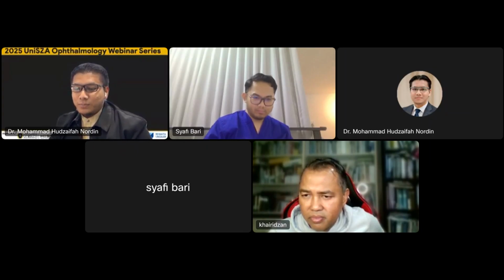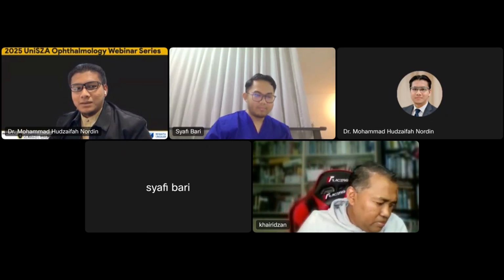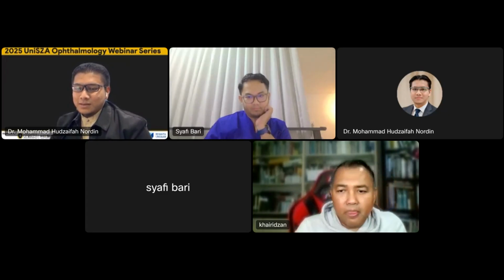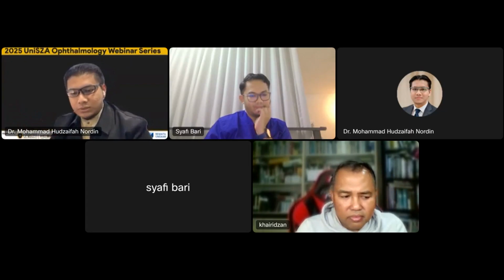But if we see the defocus just now, if we target minus to the patient, we are actually not doing justice to the patient by providing a clear vision at distance or even at near. We thought that we are providing at near, but basically distance is not good. Vision near is also not that good. So better we aim for one good vision at distance, and then if the patient requires glasses for near later, we counsel the patient for readers. I think how about Dato?